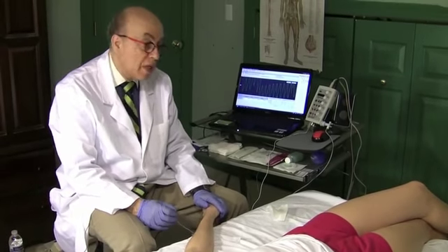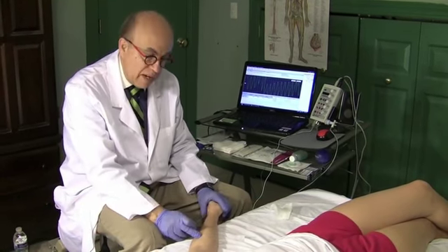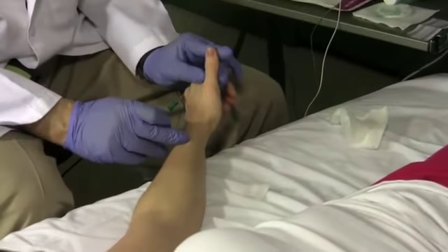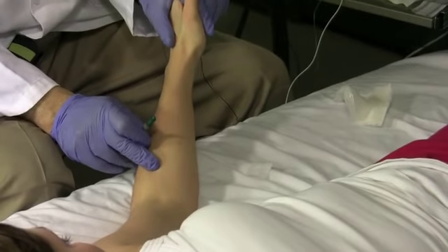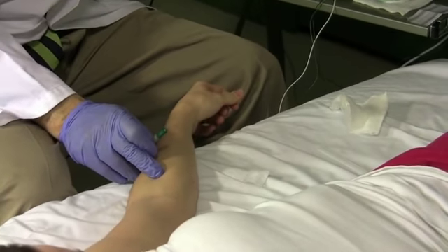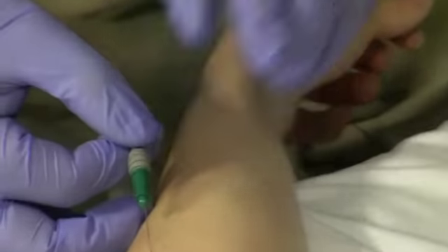The next muscle that we're going to study is the brachioradialis muscle. Brachioradialis is here. It's a radial innervated muscle, primarily C5-6. Let me show you how to activate it. You ask the subject to point the thumb up to the ceiling and raise your arm up. Raise it up all the way. See how it bumps up here? That's where the brachioradialis is. Now put it down. Okay, I insert the needle. 1, 2, 3. That's it.